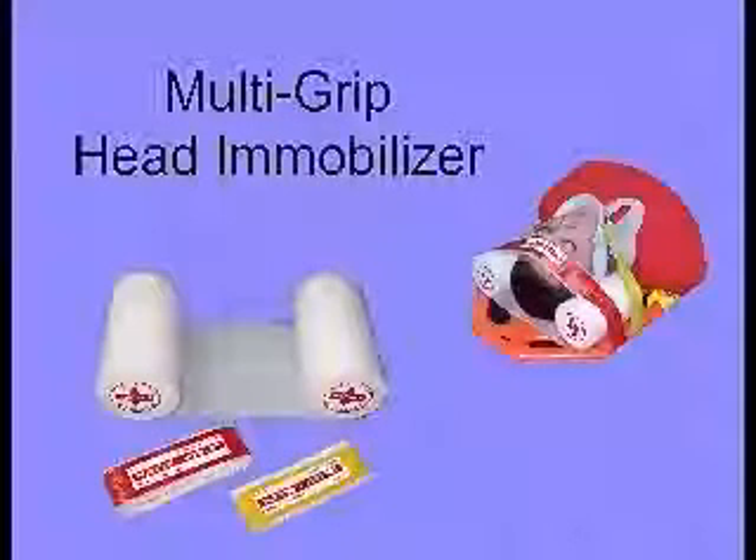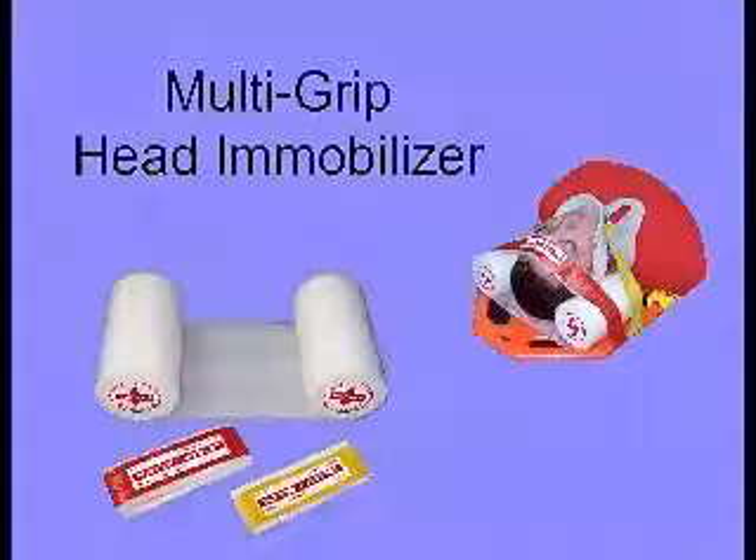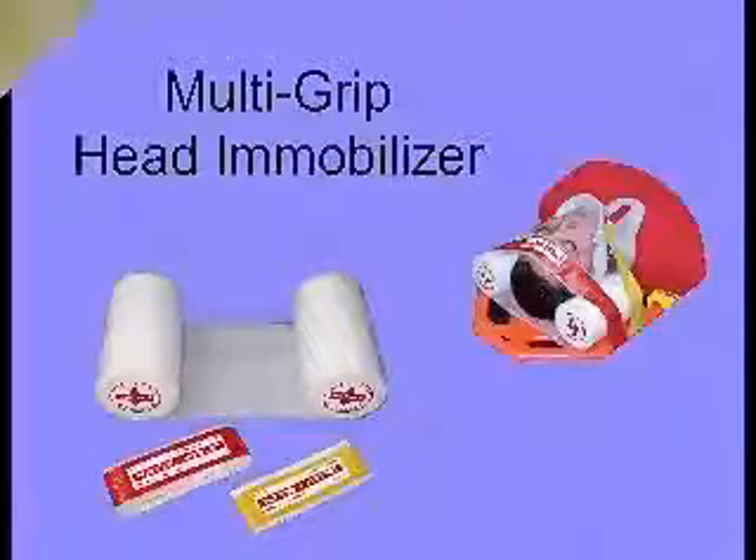I-Tech Manufacturing has produced a multi-grip head immobilizer since 1989. It is compatible with most C-collars and backboards. Each unit comes thermo-sealed with a head and chin strap.